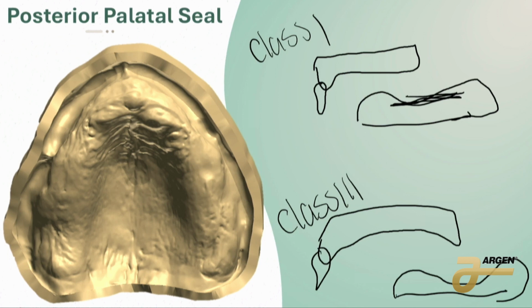And so if you have a super deep palate or a round piece of glass, and you now try to take a suction cup and stick it to it, any little teeny weeny gap of air that gets in there is going to pop it down. It's not always about material. It's not always about shrinkage. So if we're making a denture and we don't want air to get in there, if air gets in there, it's going to push the back part of that upper denture down, correct?